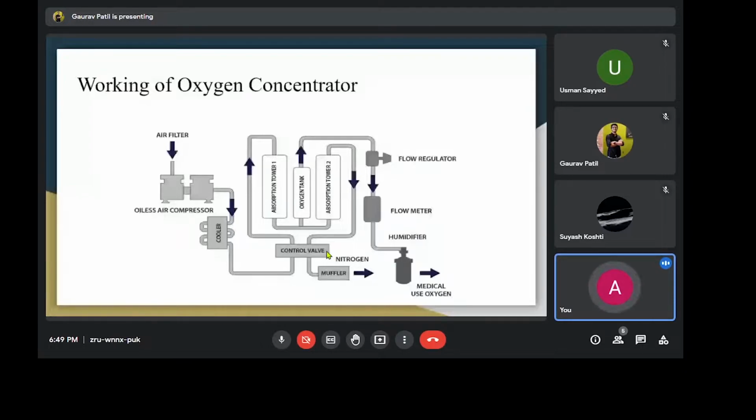The air from the atmosphere goes into the compressor through a filter to separate out the dust particles, and the compressor throws out highly compressed hot air, which is then fed to a heat exchanger. The heat exchanger is mainly used for cooling the hot compressed air, and consists of a round helical copper tube with a Peltier module for cooling the compressed air efficiently.